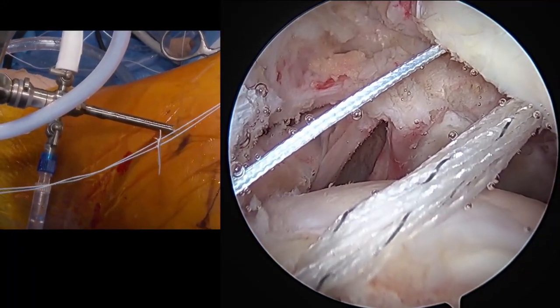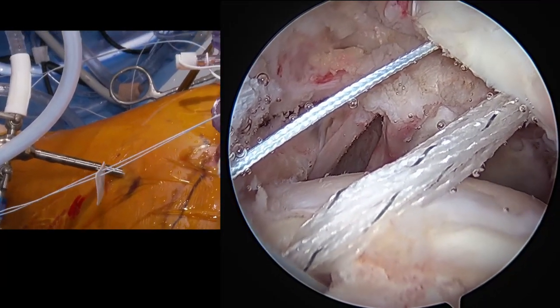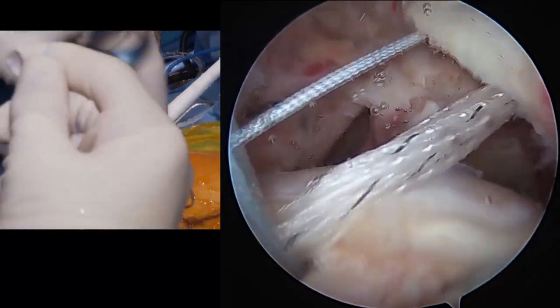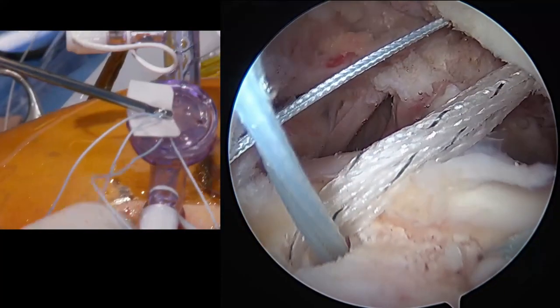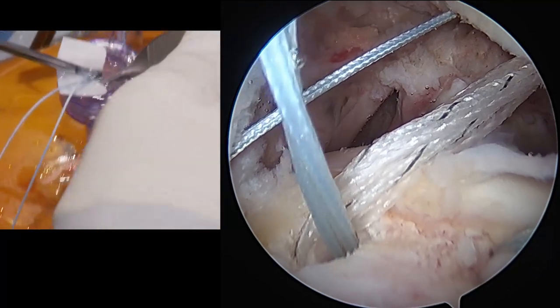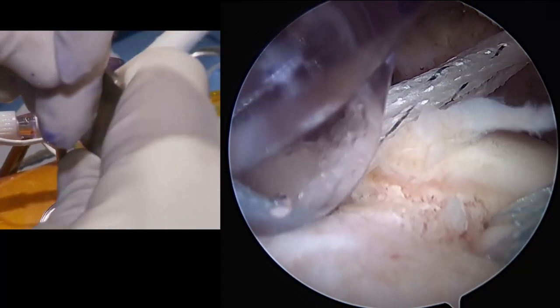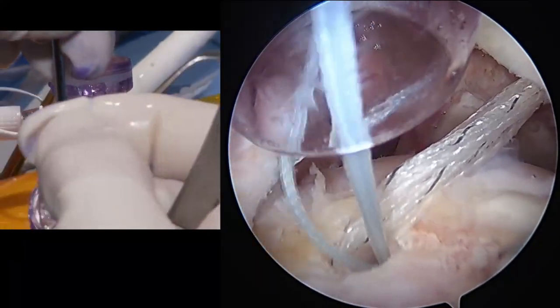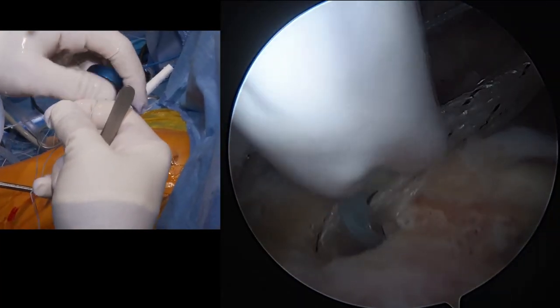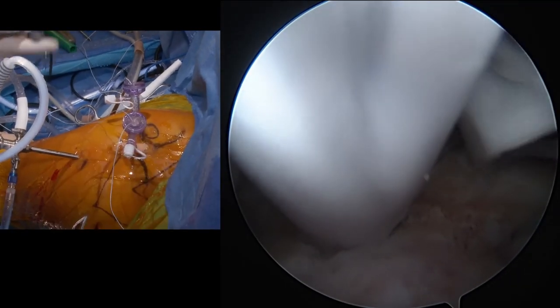And so we're just going to push this down so it'll be an interposition graft. It's made out of a nanofiber that's synthetic and gradually dissolves. But again, while it's there, it holds on to the biologically active materials. Thank you. Yeah, we'll just lay that down there for a minute.